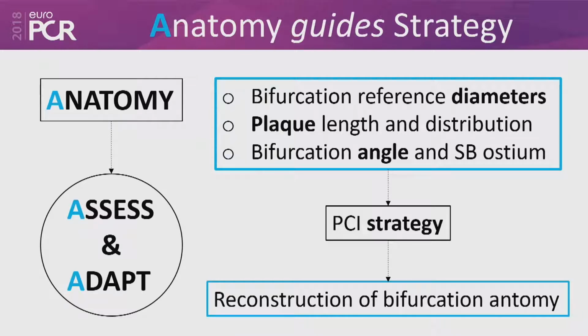So as I said, one example where imaging at least helped me understand the anatomy is the ostium of the LAD. If you have a plaque at the ostium of the LAD, doing imaging in such patients, you actually learn that most often the plaque extends into the left main.